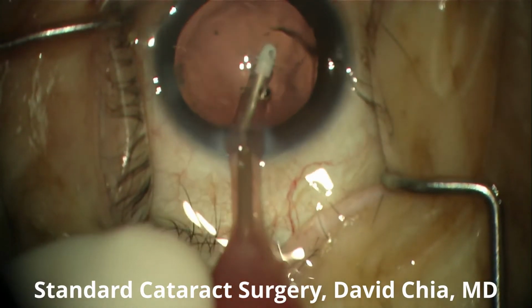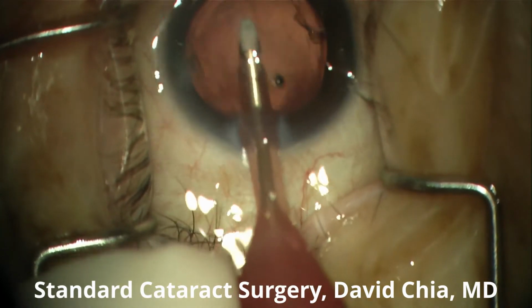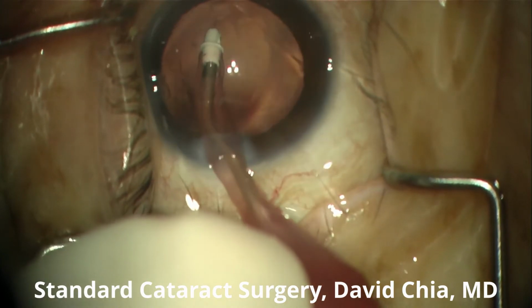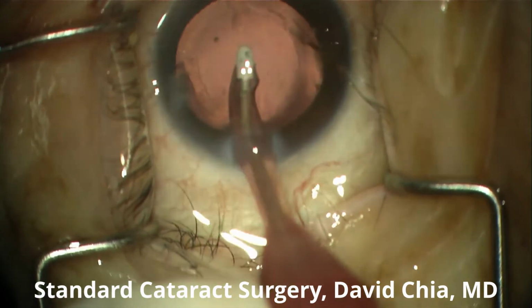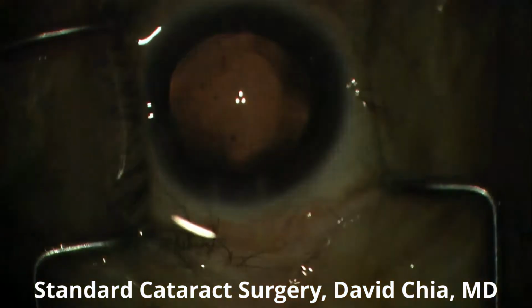And once we've done this to our satisfaction, each of these steps is quite critical, as the artificial intraocular lens will be retained in the eye indefinitely. These lenses are not currently designed to be interchangeable.